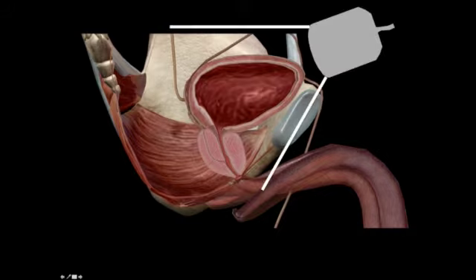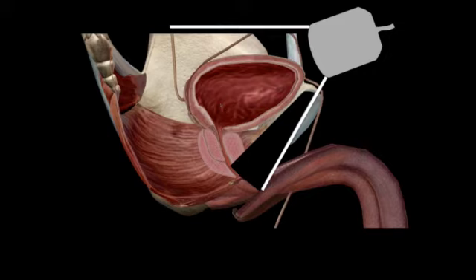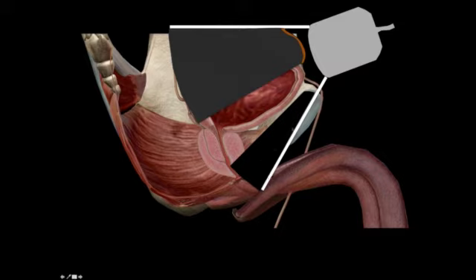The problem is that you've got this symphysis pubis, which is shadow casting, and you can see that cuts off that bit of view. And unless you press firmly, you often get a bit of bowel. Now, bowel full of poo and gas cuts your view as well with posterior acoustic shadowing. So you see this is nice clean shadowing from this bone. This is gas here, and it's got dirty shadowing. And so really, if I look like this, the only bit of bladder I can see is this little bit.